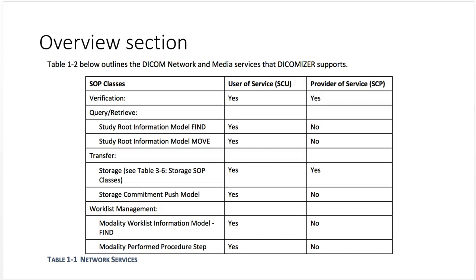Is C-Echo supported by this device? Well, C-Echo is the verification SOP class, and yes, it's supported as an SCU, and yes, it's supported as an SCP. So that tells me that, yes, I can both C-Echo to and from this device.